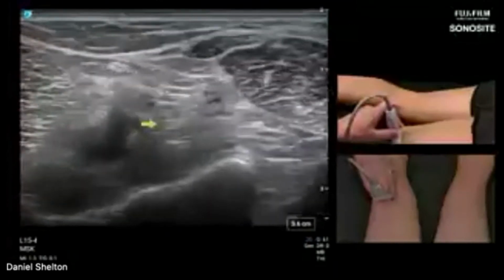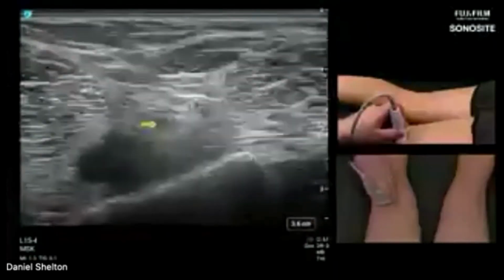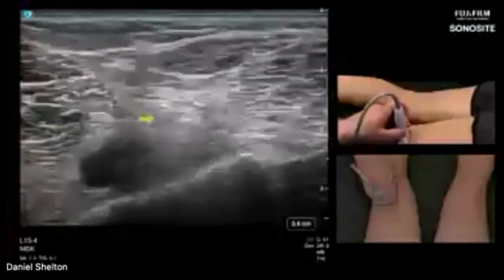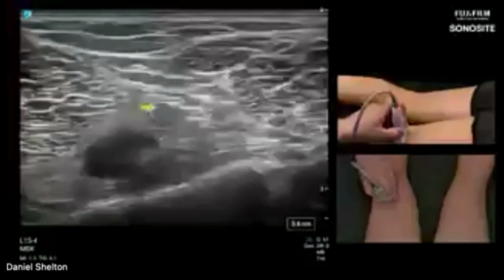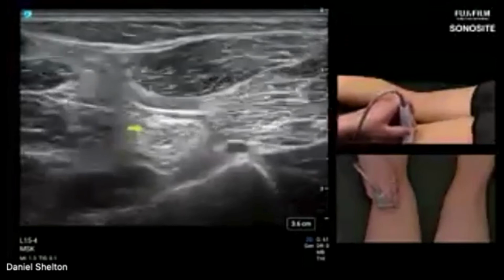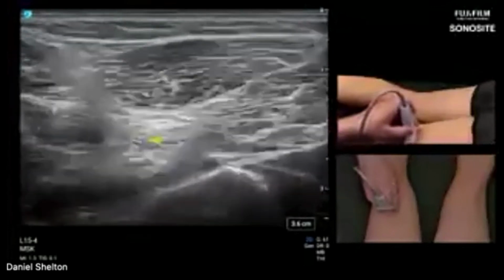So it can be frustrating to scan these nerves. You just take little 1-inch bites, up, down, up, down. We're going to pan proximal, distal, and just chase this proximal tibial nerve up to the distal sciatic here, and just back, forth, back, forth. Right here, I can see that bifurcation take place.